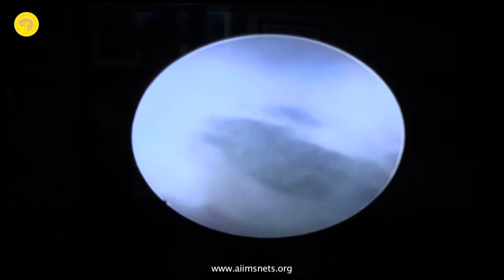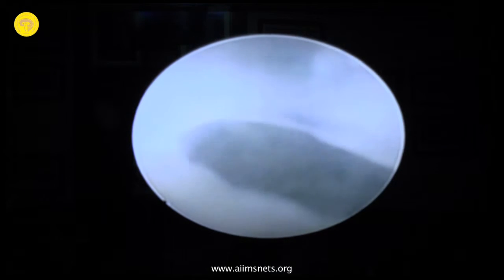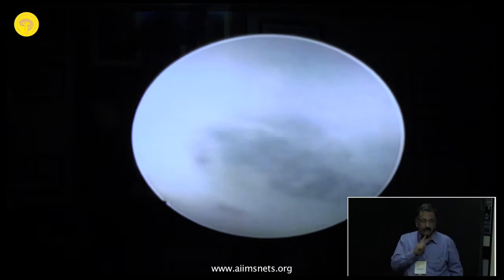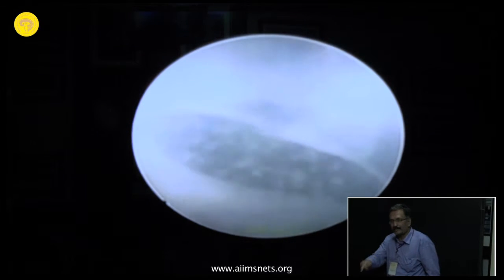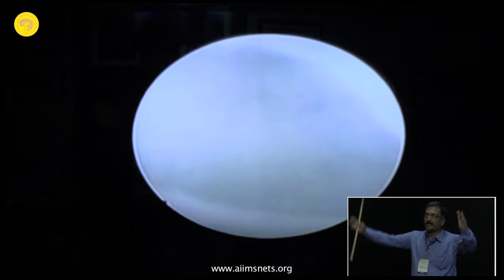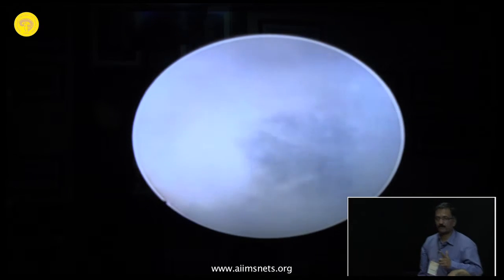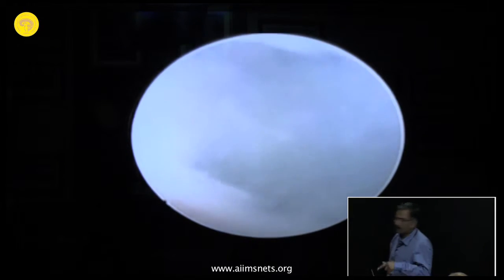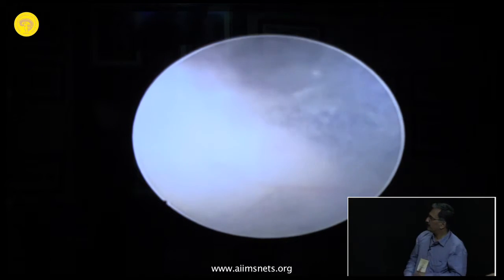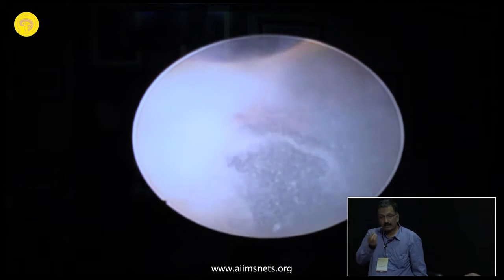So again, the same thing: this whole thing is completely hazy, you don't know where you are. And it's very, very complicated. You just keep waiting and irrigating. Another problem sometimes is that you don't actually get to the bottom of it, and just making one fenestration is not adequate, so you have to make a double fenestration to reach the lower part. Without a double fenestration, there's no point. This especially happens when there is calcification and a very thick membrane.